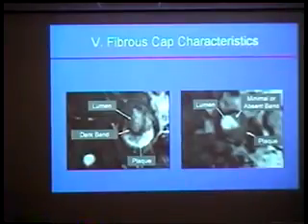It's indicating this actually is hemorrhage again. But separating this area from that area, there's a dark area separating the two. We pretty much figured from the histology that this is a layer of fibrous cap or the fibrous tissue that separates plaque bulk from lumen.